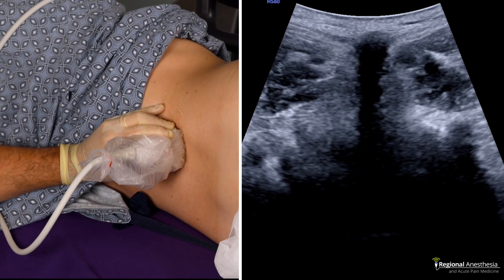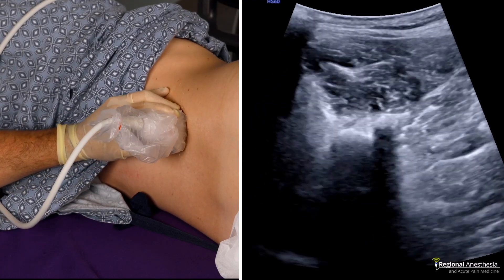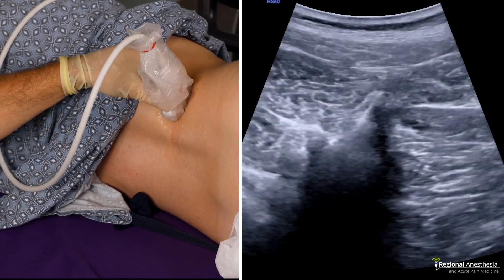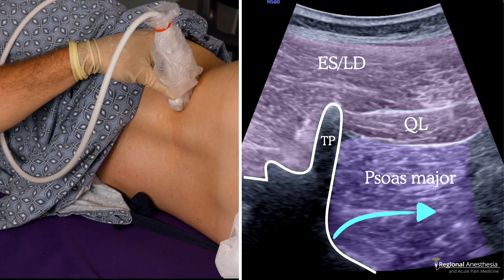Here's that scanning progression. We see the shadow of the spinous process first. Then, as we move lateral, we'll see the articular facet and the transverse process. We rotate the beam into the middle of the patient until the transverse process appears to point to the top of the screen. We now appreciate the superficial erector spinae and lat dorsi muscles, the QL muscle, and deep to that, the psoas. The roots of the plexus emerge from the foramen and pass into the psoas muscle.